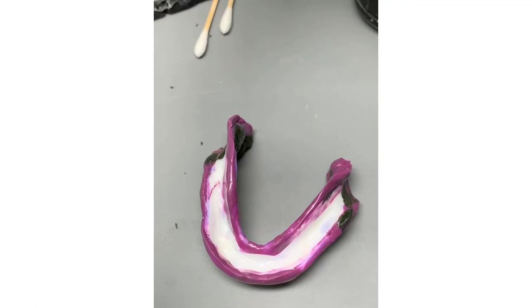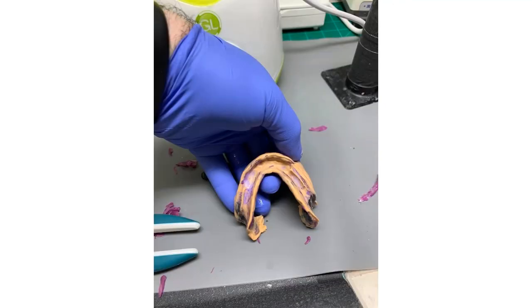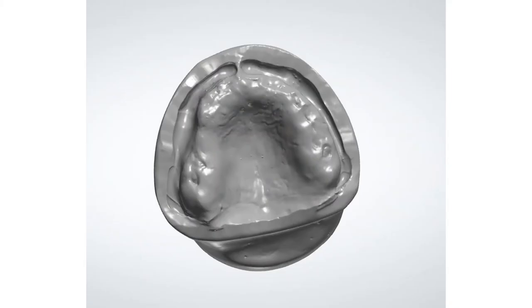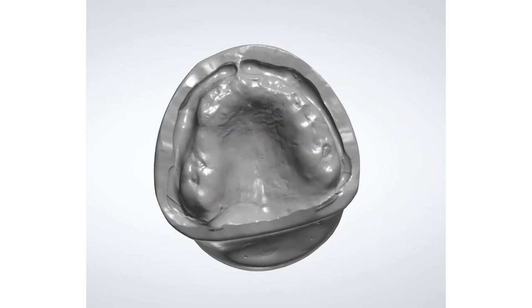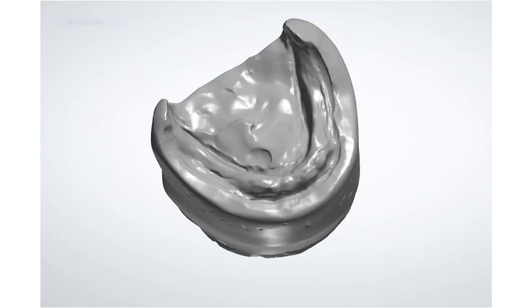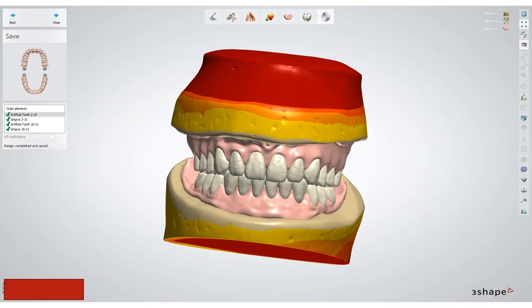There's also a thermoplastic granule material made by different companies — you put them in hot water and can mold the tray with them. They allow you to create better extensions without being brittle. We did that here, and you can see how deficient it was on the distal. From there we refined the edges with medium body and did a light body wash impression. Looking closely you can see the areas not fully healed from where the bladed implants were taken out — the infection was very severe. So here is her maxilla and mandible. I poured everything up, mounted the case, and scanned it in.